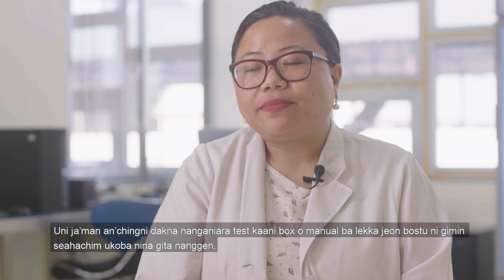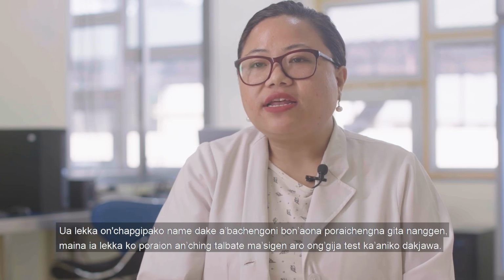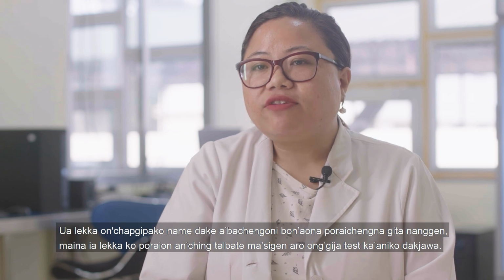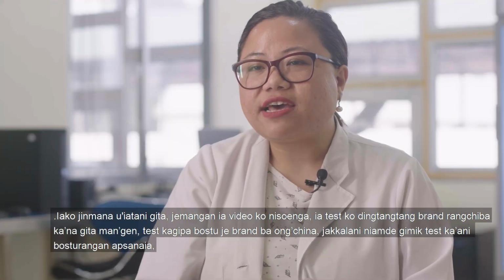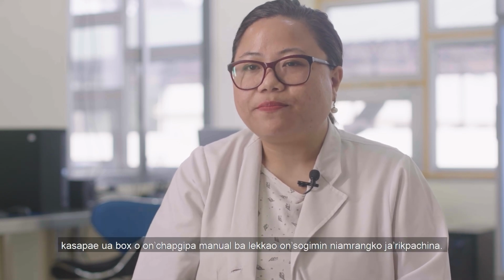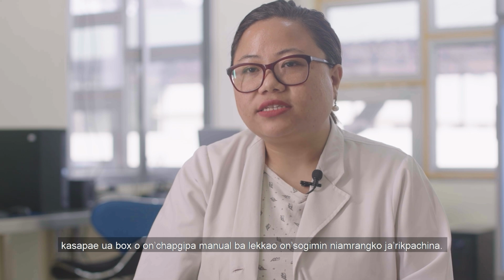The fifth step, please make sure you go through the manufacturer's insert manual before performing any tests. Read it carefully from introduction to result interpretation so that you do not fumble and you do not make any kind of mistakes. For the information of everyone viewing this particular tutorial, different type of tests can be conducted using different type of brands or manufacturer, albeit the principle is still the same. Please go through your manufacturer insert kit thoroughly and carefully and follow it step by step.